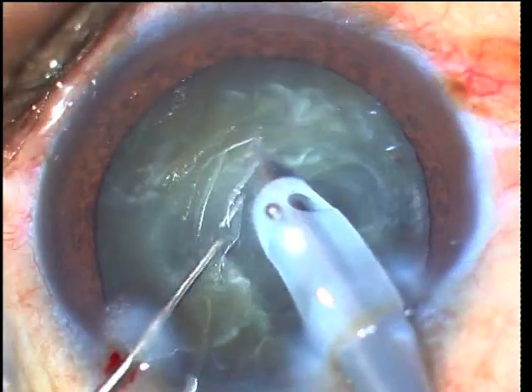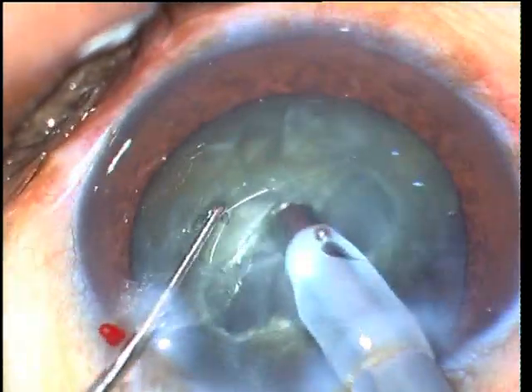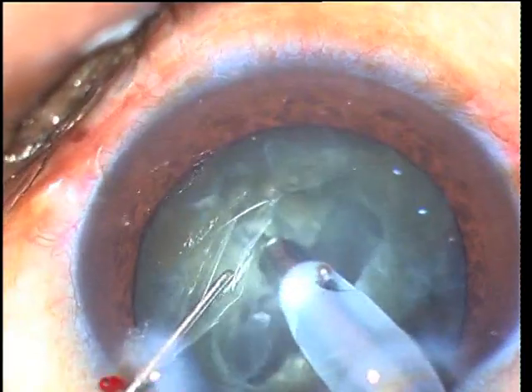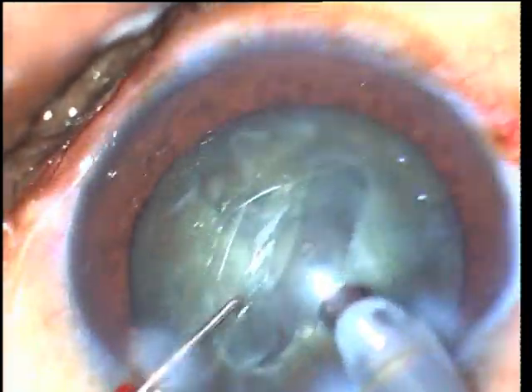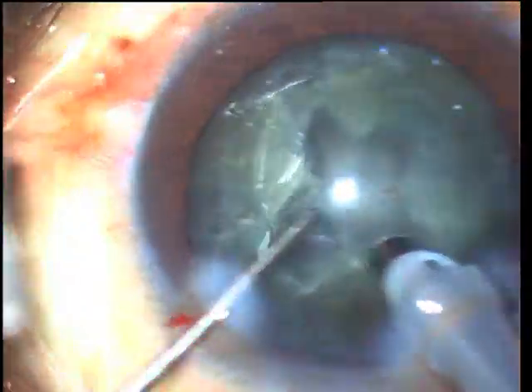Sufficient power should be used based on the nuclear density. Insufficient power can lead to the nucleus being pushed forwards and this can lead to zonula stress. Similarly, low levels of vacuum should be used. Higher vacuums can cause the nucleus to stick to the phaco probe and can cause inefficient sculpting.